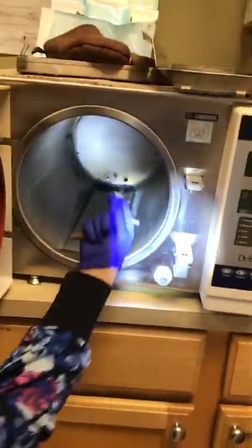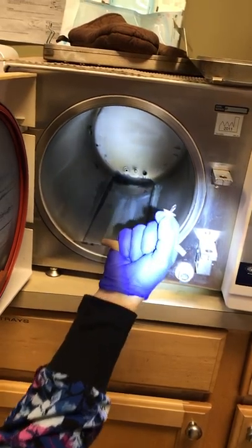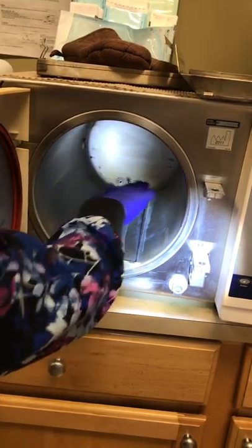And then this little guy here, which is on the left, we're going to pull him out. It's going to be hot, so then we're going to put that down. Scrub out the inside.